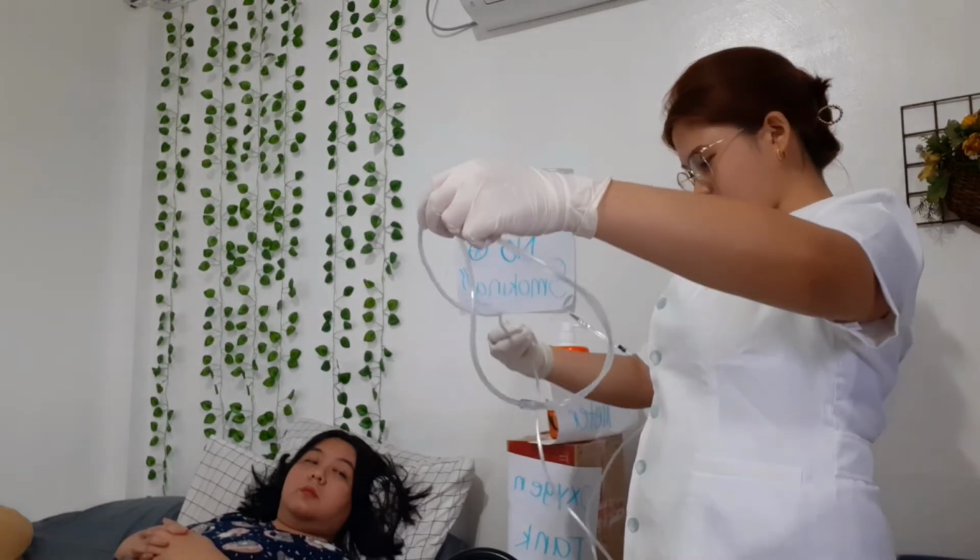Then what is the rationale for that? You need to avoid escape of oxygen through the tubing in order to facilitate proper flow of oxygen through the tubing of the patient. So you can see here if there are any bubbles as the oxygen flows through. So what is the rationale? It ensures the equipment is functioning well. So as I've seen, there are no bubbles because this is a nasal cannula that you need to connect to the patient as well. So you need to feel the oxygen at the outlets of the prescribed oxygen device.